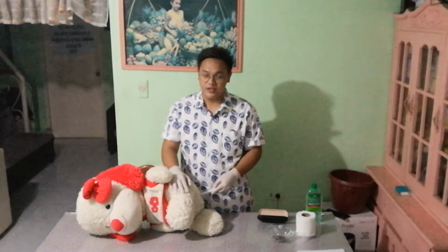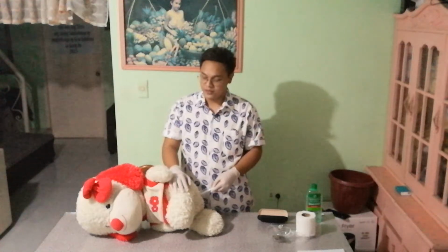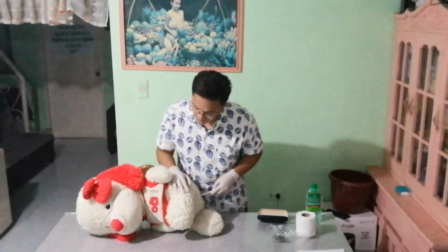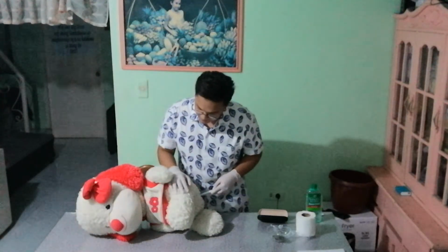So for the seventh step, we need to hold the thermometer until we hear a beep. Assuming that we already heard the beep, we need to remove the thermometer carefully. Ma'am, I am about to withdraw the thermometer.